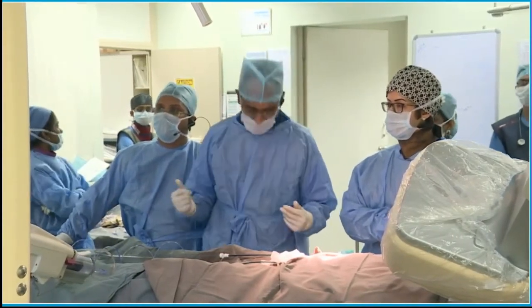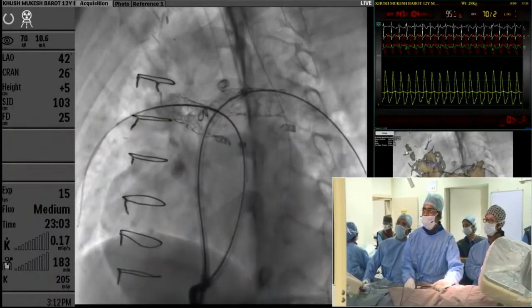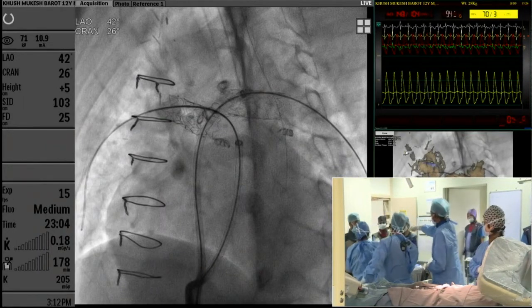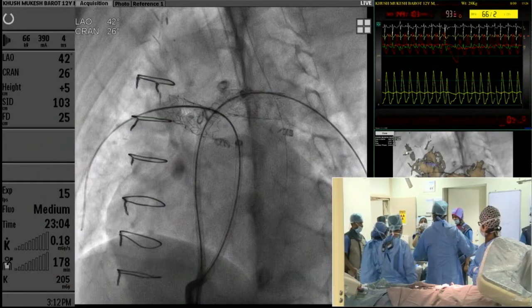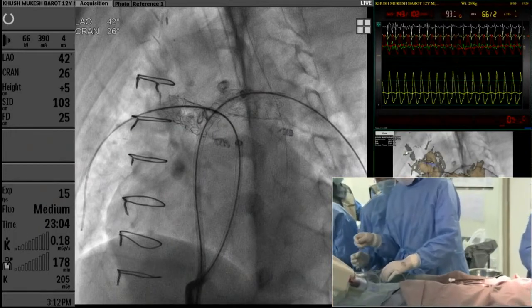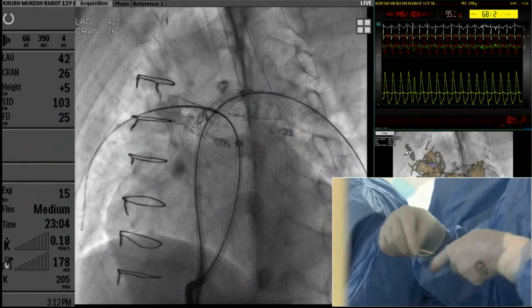Yeah, 14 into 2 is a good idea, but many times 14 into 2 are small length, 75, so they may not come out of the sheath. Confirm that you have adequate length to come out of the sheath. Yeah. 14 by 2, what is the length? 100 centimeter. We are fortunate to have a 14 into 2 Atlas, regular Atlas. Dr. Bharat pointed out that it will be nice to have an Atlas Gold which has got an extremely small taper, but it is not freely distributed within India.